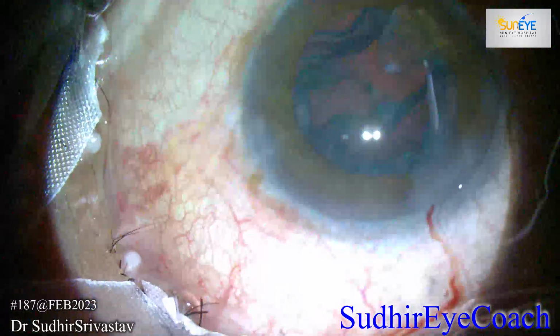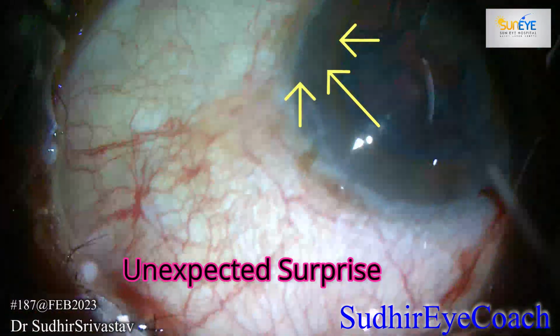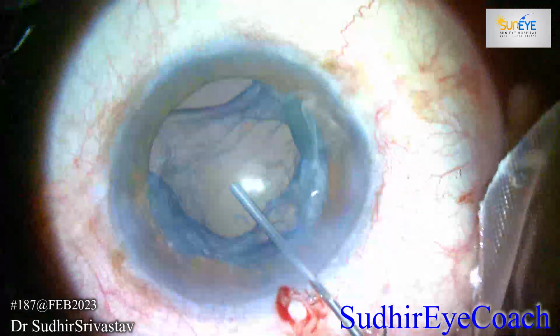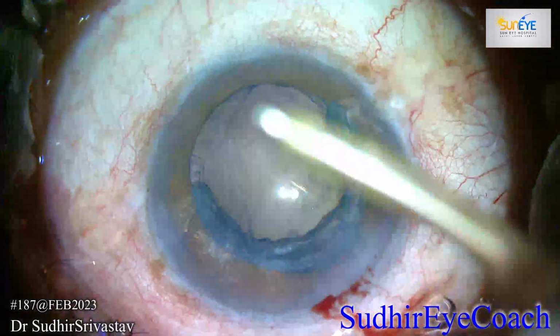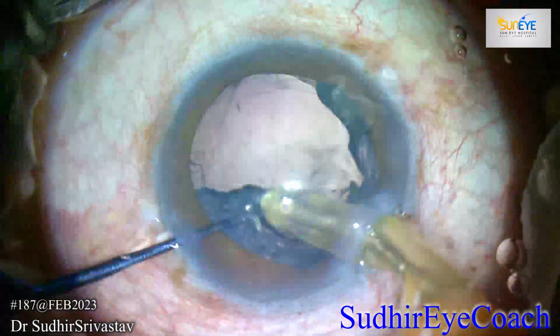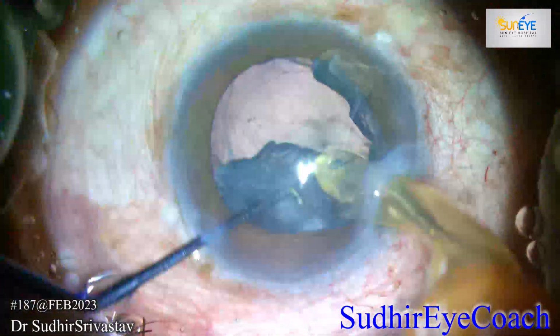As I withdrew, I realized the surprise was in front of me. I saw a capsular bag dehiscence. So I filled the anterior chamber and bag with viscoelastic and assessed whether there was any forward vitreous movement. Since the dehiscence was limited to a smaller area, I thought to continue the cortical cleanup.